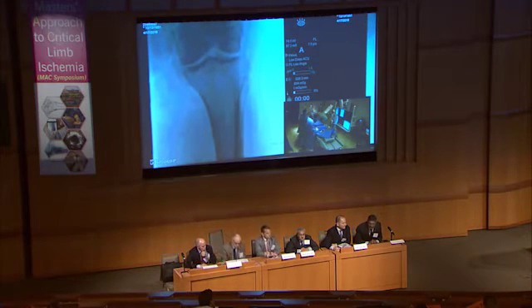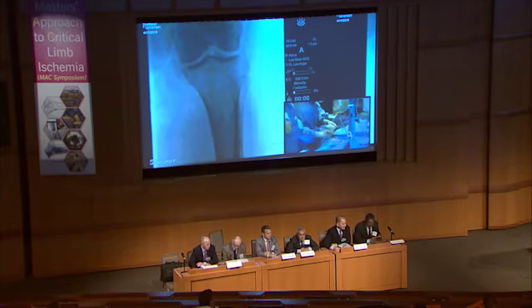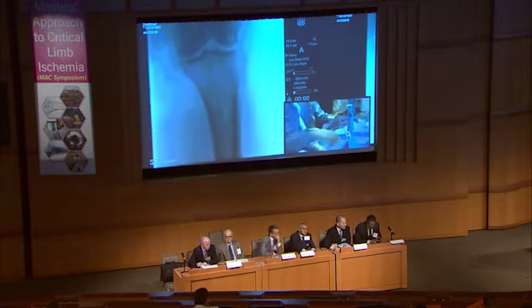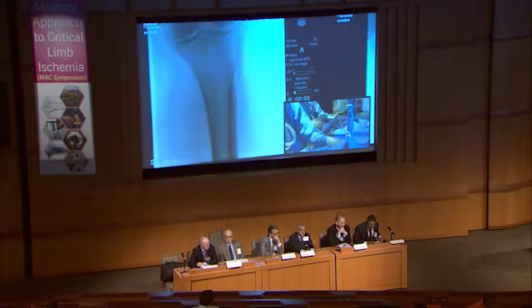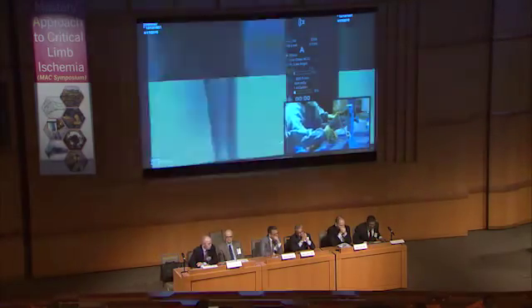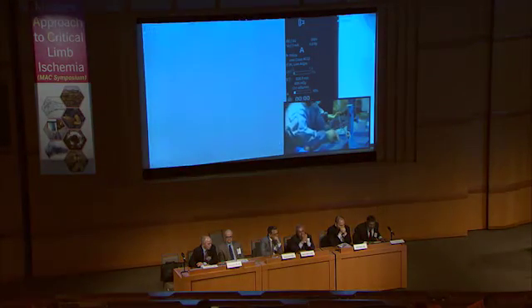Everything I could below the knee, yeah. So Mehdi, I don't know how much time is left, but you have a charge to go after the below the knee vessels, at least a few of them, if not all. What's your thought? I agree. We are having some technical issues, I apologize, but I agree, and that's what we're going to do.